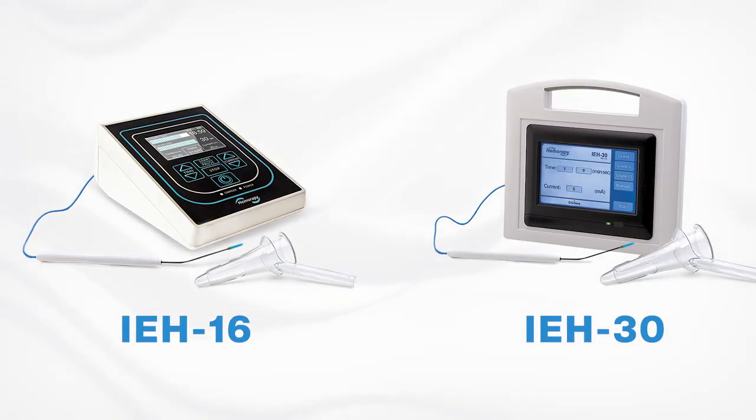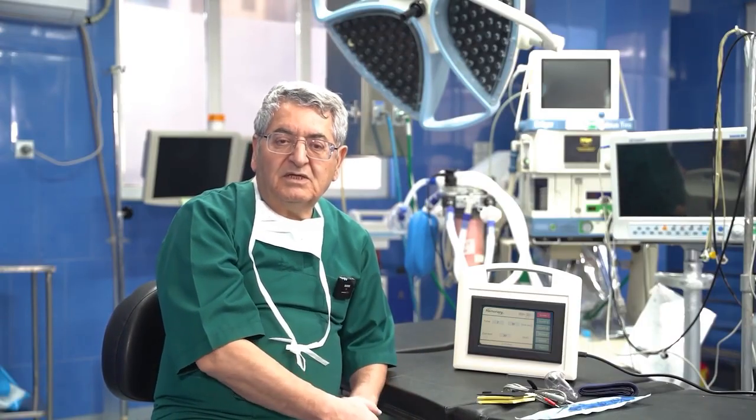if we want to perform the procedure using anesthesia or numbing, then we can use the device at up to 30 milliamps. In intermediate grades, we can use either of these settings, whether 30 milliamps or up to 16 milliamps. The only thing that changes is the duration. If we use up to 16 milliamps, usually the time required for grades 1, 2, and 3 is longer, and it may take more time.